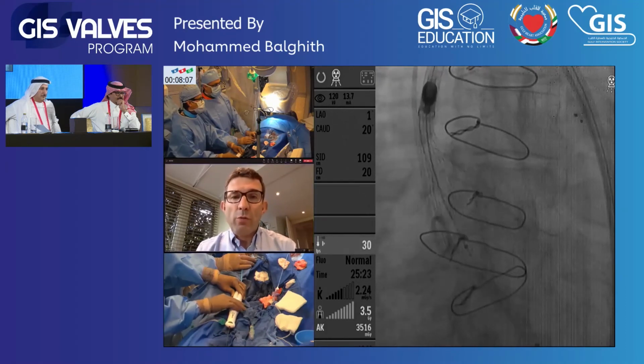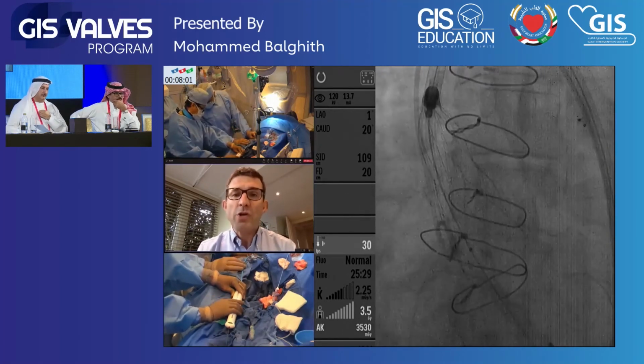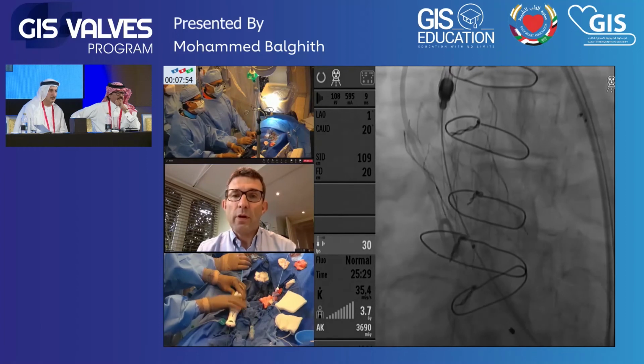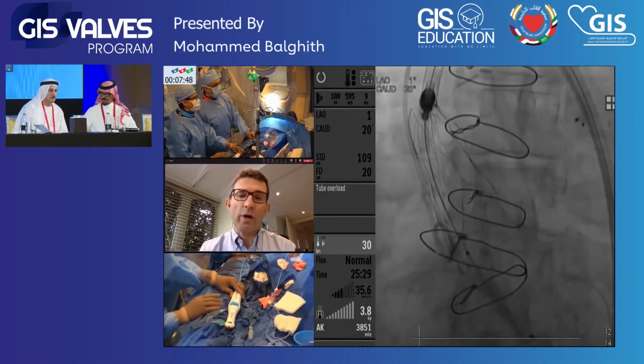So what I would do is I would do this under acquisition just to make sure you're happy. So you're going there anyway. So just continue. If you switch to acquisition, now fully release. Beautiful. All the way to the end. Okay, done. Excellent. Well done.